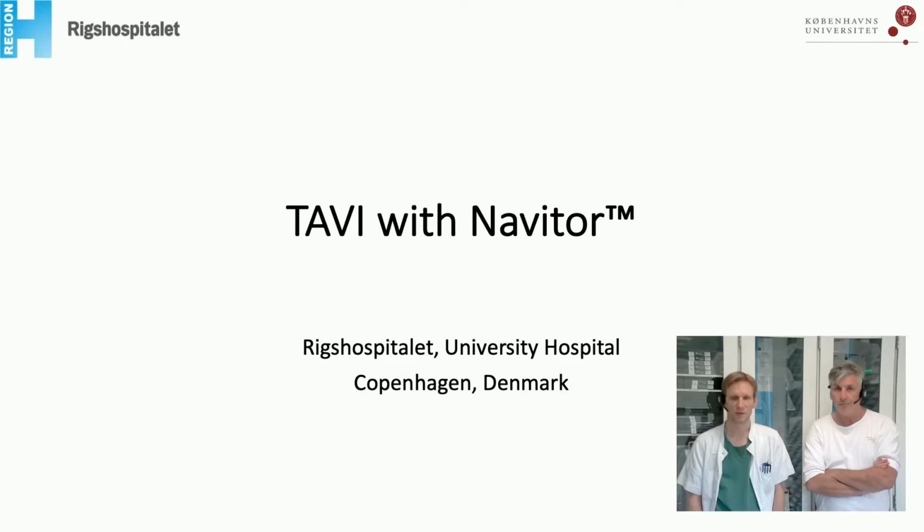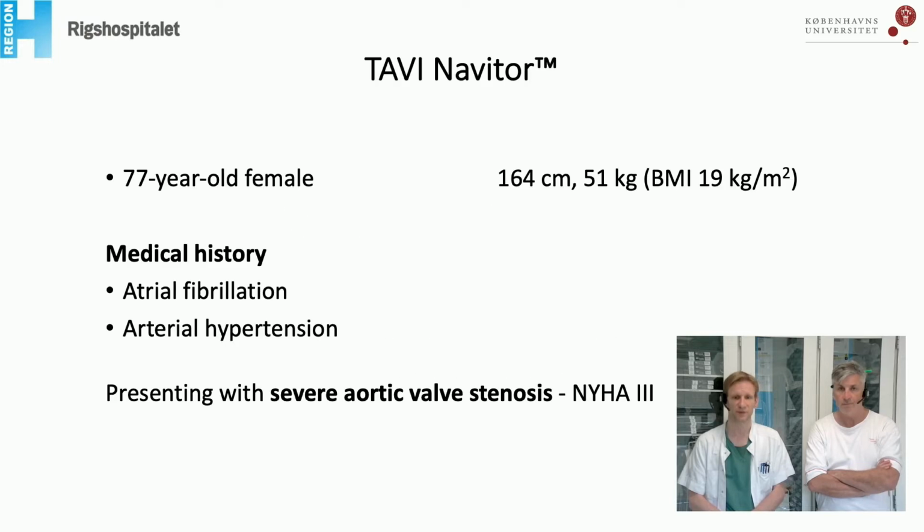So if we can start the case now, please. Welcome to Copenhagen. I'm here with my colleague Ole de Backer, and before we go to the case, Ole, maybe you can give a short presentation of the case we're going to treat today. Yep, sure. Okay, so let's go to the slides. So this is a TAVI case with the new Navitor valve from Abbott.